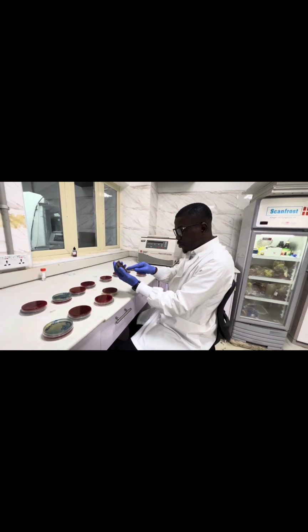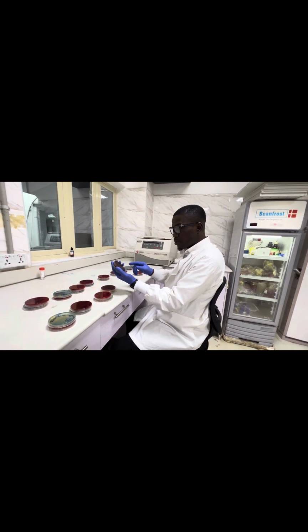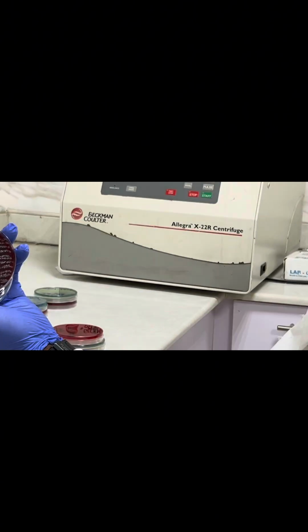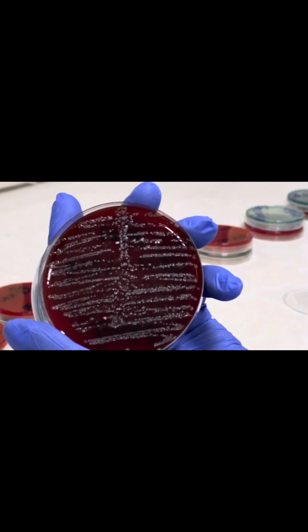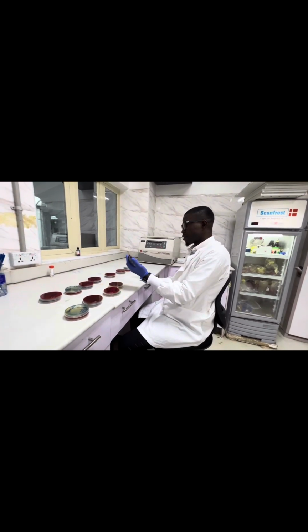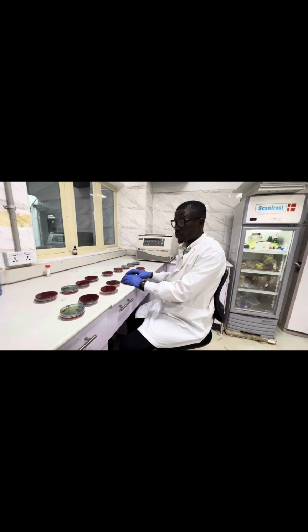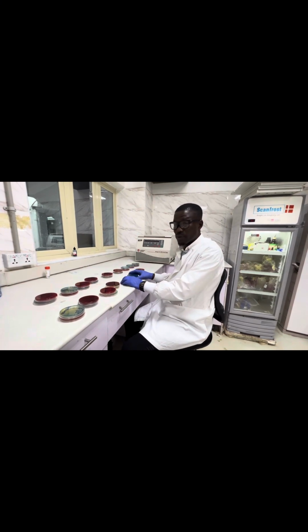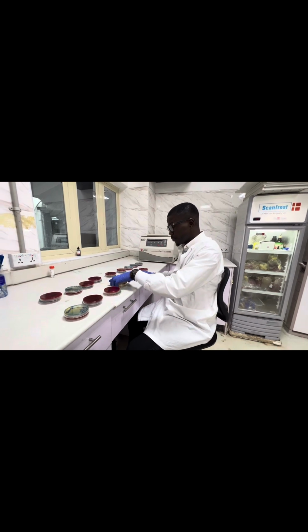Then the golden color appearance is also here. So there are about 4 colonies. Like I said, in this case, this is a perfect mixed growth. So it is likely that the patient didn't produce this sample appropriately, and the patient will be advised to produce another sample.